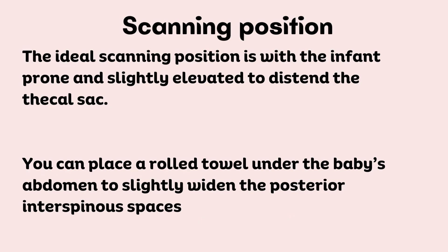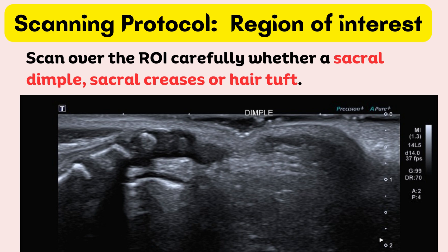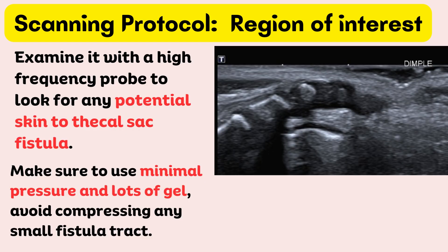The ideal scanning position is with the infant prone and slightly elevated to distend the thecal sac. You can place a rolled towel under the baby's abdomen to slightly widen the posterior interspinous spaces. Spinal ultrasound is performed in both the longitudinal and transverse planes using a linear 5 to 12 MHz transducer. Scan over the region of interest carefully, whether a sacral dimple, sacral creases, or hair tuft. Examine it with a high-frequency probe to look for any potential skin-to-thecal sac fistula, using minimal pressure and lots of gel to avoid compressing any small fistula tract.